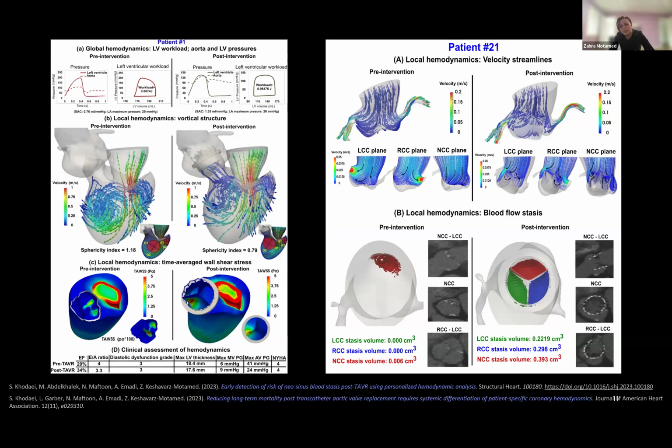So in one case that you see here, the patient has severe AS and received TAVR, and because of changing physiology and pathophysiology, changing the forward stroke volume, a little bit of paravalvular leakage or whatever. But if you look at the mitral valve side, you will see clearly and qualitatively that the mitral valve wall shear stress also increased significantly. The other thing you will see on the other side is stagnation.